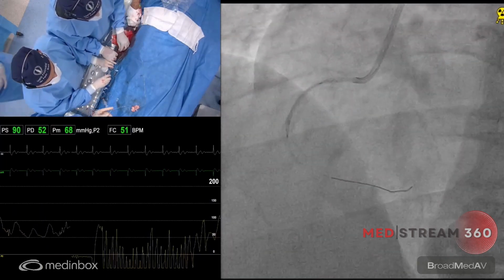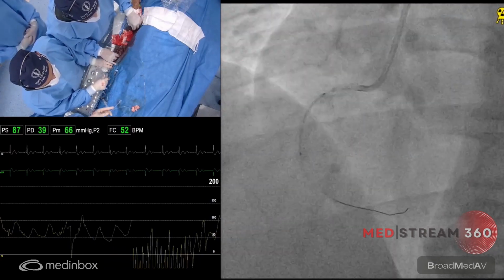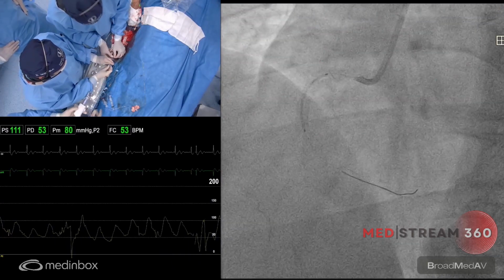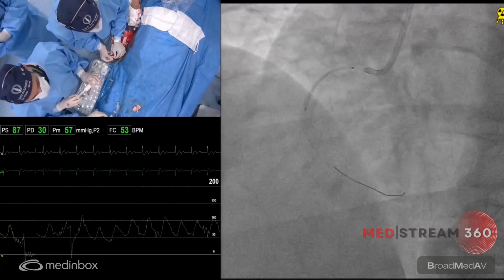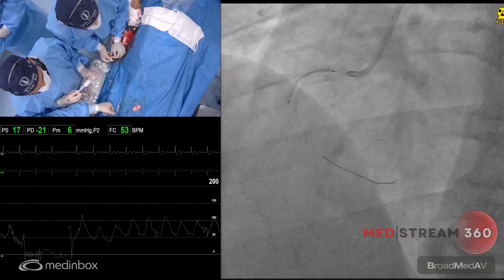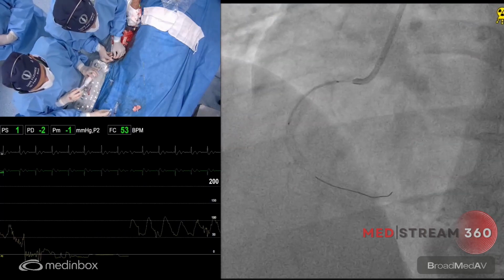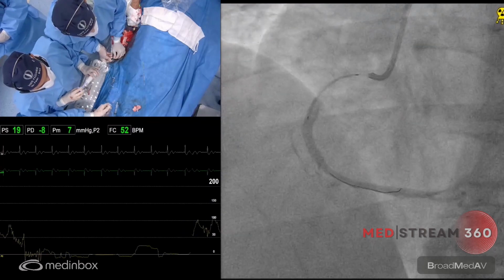Yeah, and we have seen also some cases that even if you cannot go too deep into the distal portion, the IVL in any calcified region can make a difference in helping make room for further treatments. Rodolfo is so careful to cover all the place where he inflated the balloon, the proximal part of the lesion. One more test to see the proximal. Yes.